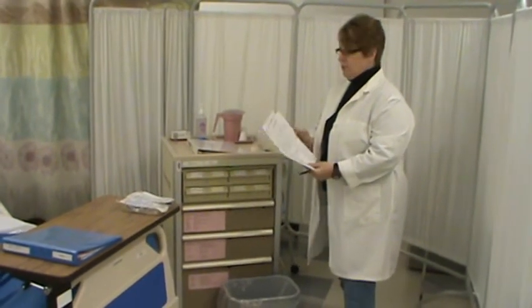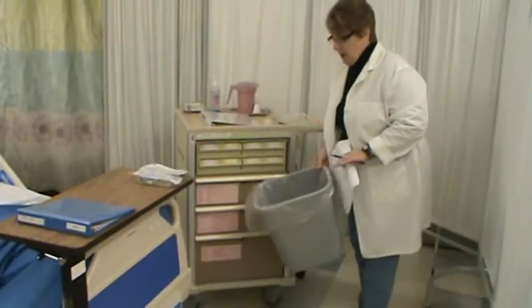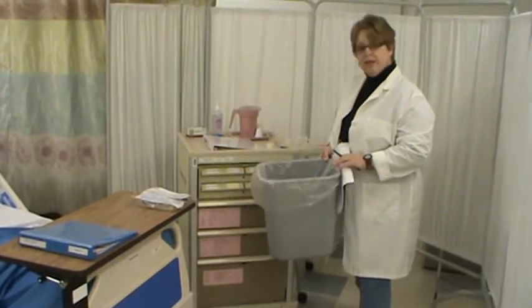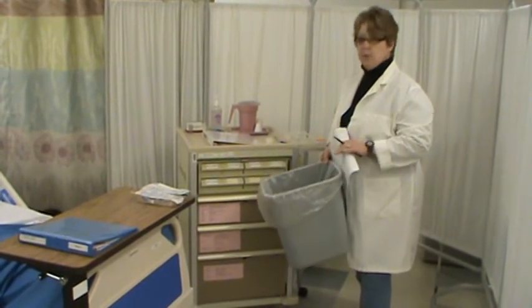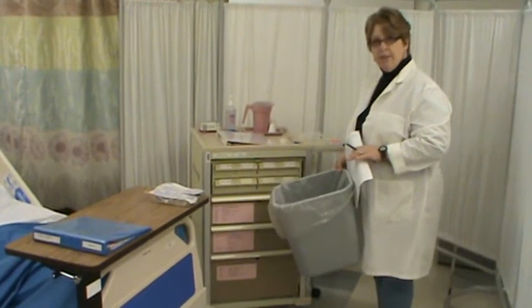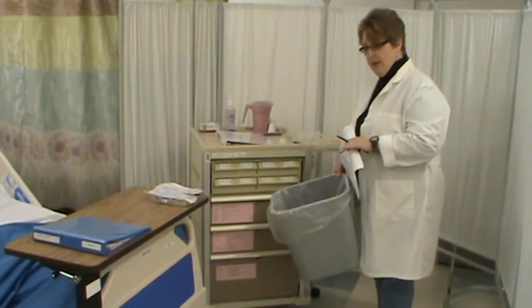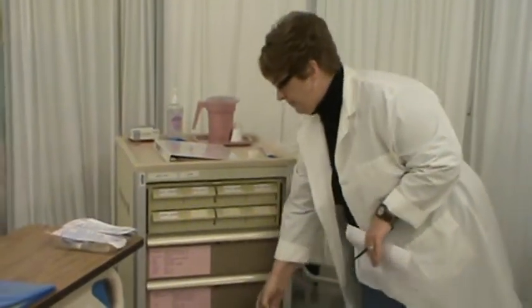The primary will be set at 20 drops per minute, and the secondary will be set at 40 drops per minute. And we'll show you how to do that here shortly. Your solutions will drip into a garbage bag. That's the safest way for us to handle this, since we can't actually infuse into our mannequins. So you'll demonstrate setting the primary, you'll demonstrate setting the secondary while the tubing runs into the garbage can.